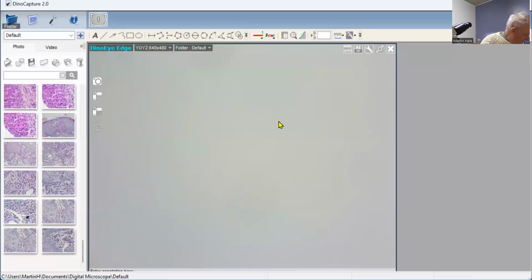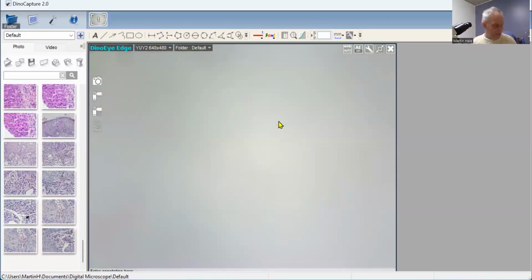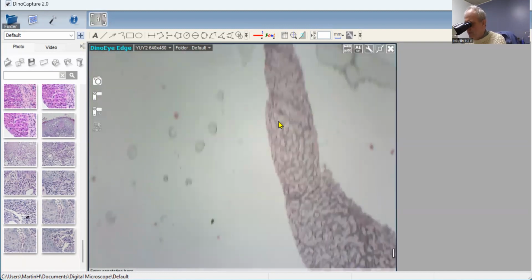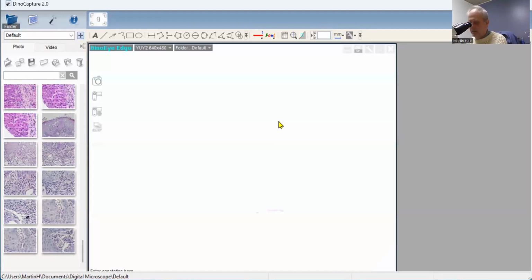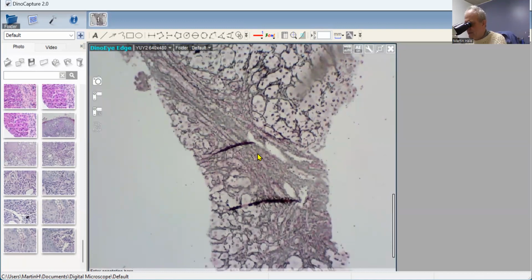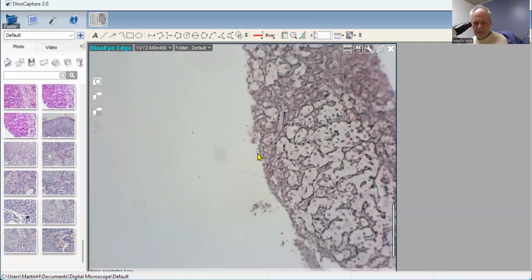So before we phone Bilal, which is what we do on a daily basis, we look at the Sirius red. And in fact, let me look at the retic first. When we look at the reticulum, we can see that we've got this expansion, as you see there, of the portal tracts. So you can see a fair degree of significant liver injury here.